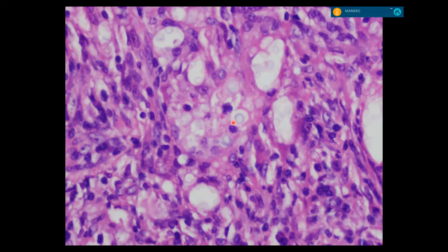You know this is not histoplasma because it doesn't look like the previous one. So you're down to 3. Blasto. There's no broad-based budding. It's not blasto. You're down to 2 now. It's crypto or cocci. Crypto is small, similar to histo. Cocci is big. It's cocci.